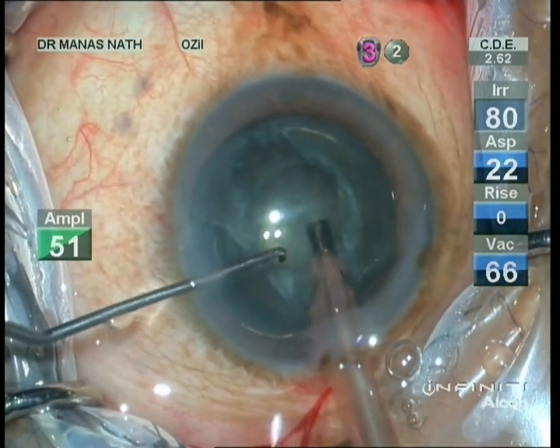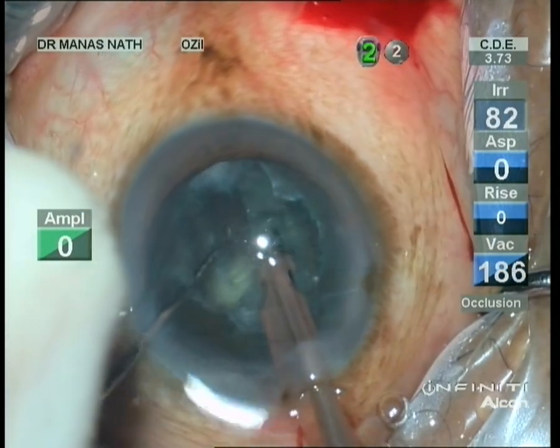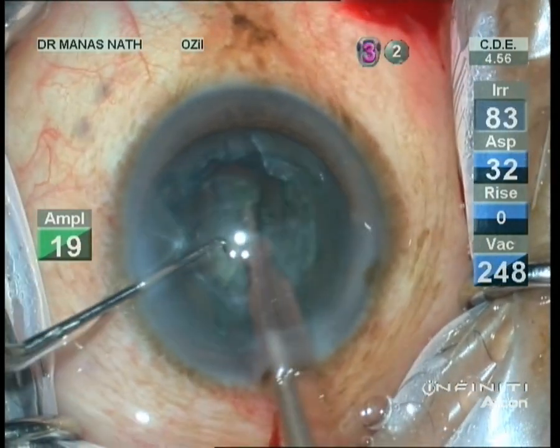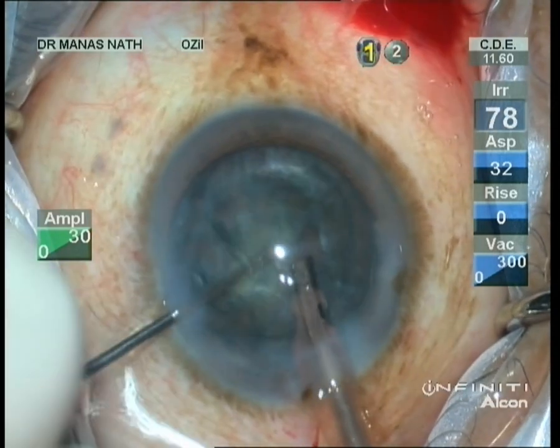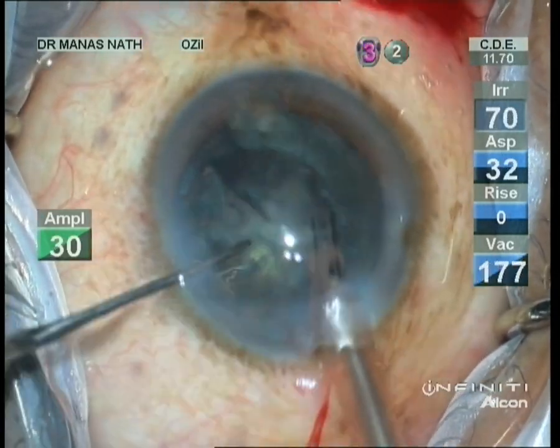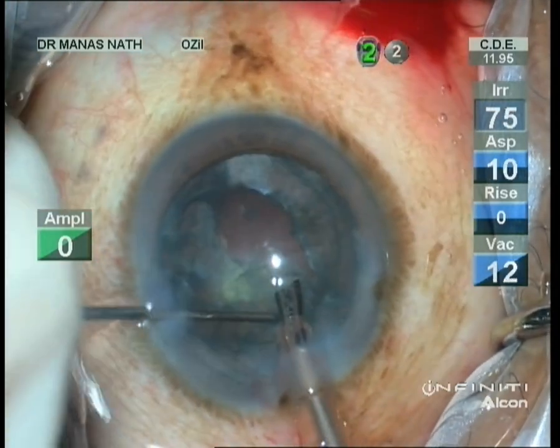We start with lower parameters, making a short trench and dividing it. The cataract also had nuclear sclerosis of around grade one to two, so both heminuclei could be lifted with the second instrument without much rotation.